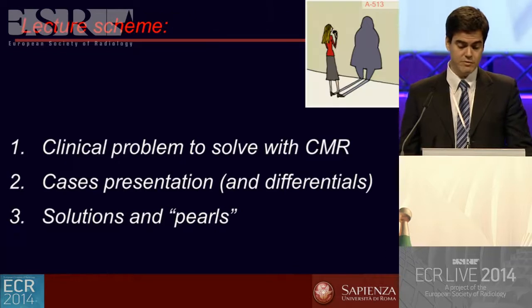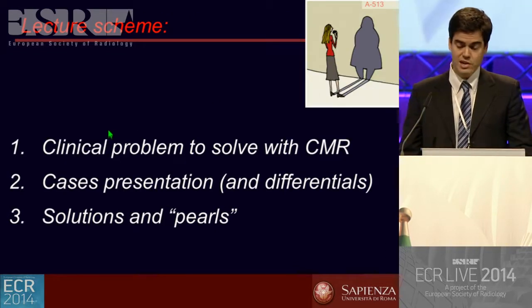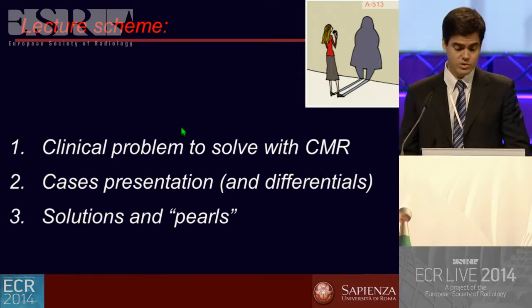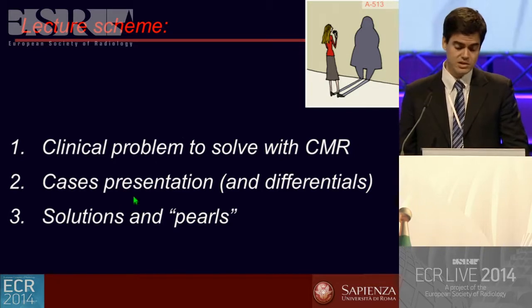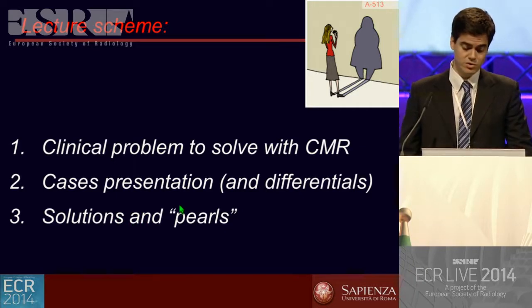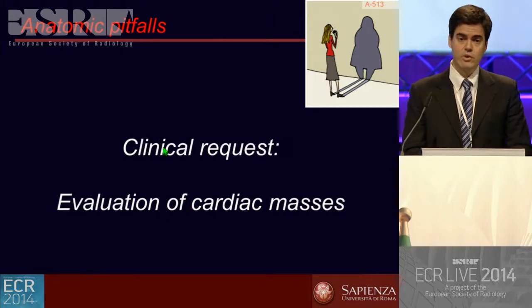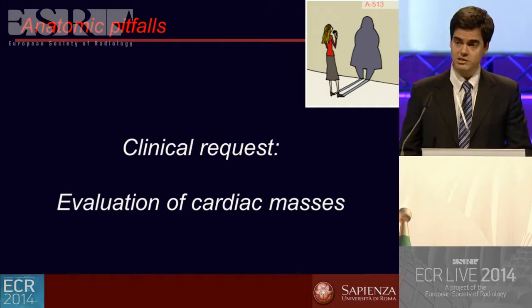Starting with anatomic pitfalls, how will I manage them in my lecture? I will show you the clinical problem to solve, so a kind of simulation of the clinical request we receive. We will discuss one or two cases related to that clinical request, and hopefully I will manage to offer some pearls, as the title of the lecture promises. So, the first group of clinical requests we are very often addressed with is evaluation of cardiac mass.